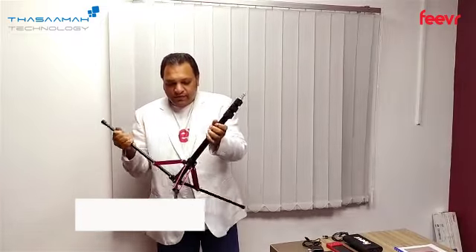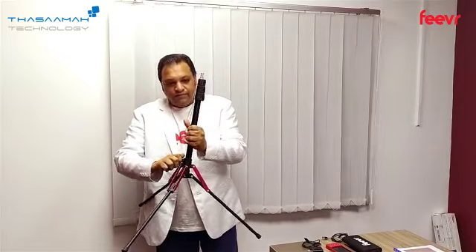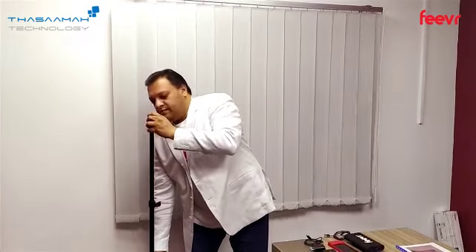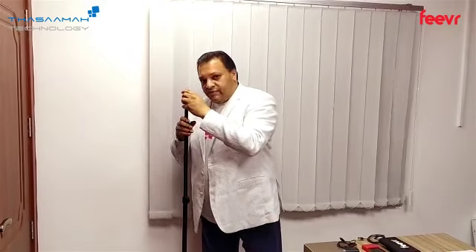Everyone, just wanted to show you how the installation of the Feevr device is. This is a tripod, as I've explained earlier in the video. You can just open this up like this, lock the device, lock the clamp here, open the clips, keep it to your nose level.